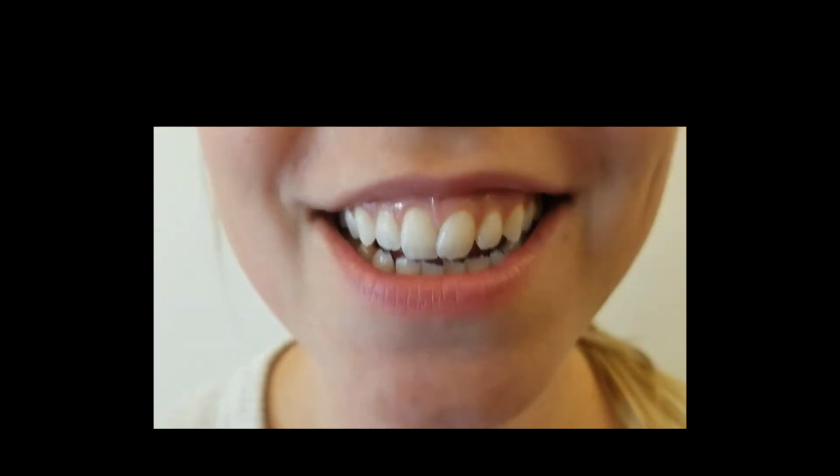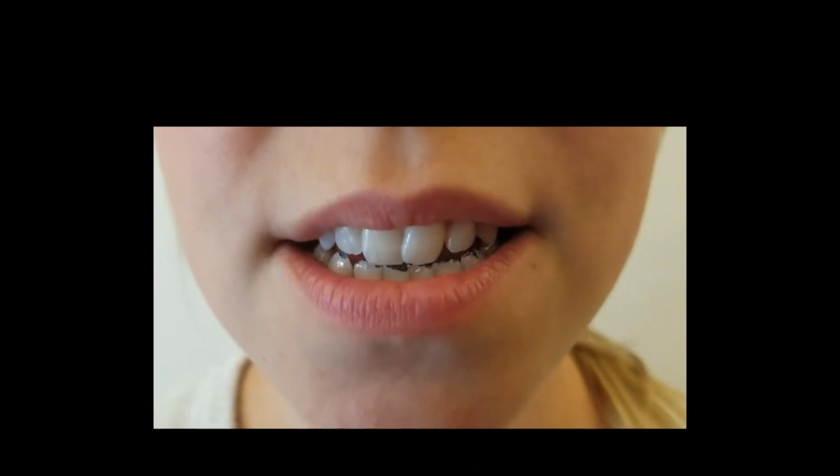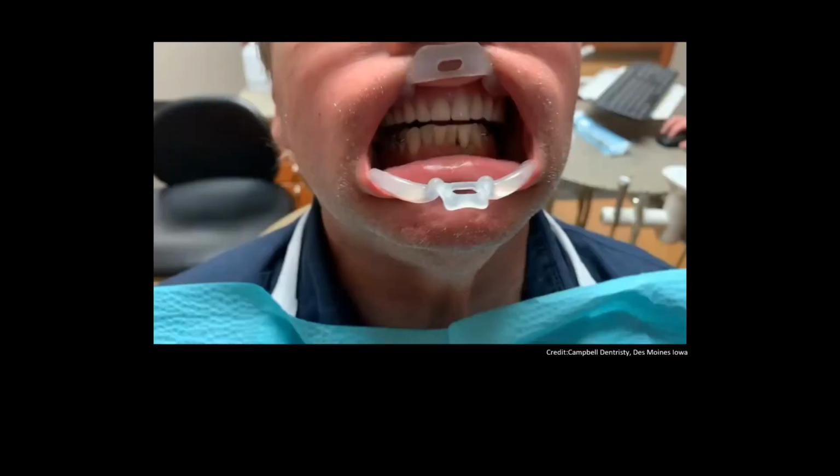This one, again, I colored the teeth on the bottom just so you can see. You can see her jaw posture. It comes out to the left a little bit, or actually her right even a little bit. So these are things that you can start to look for. So this is a complete upper denture to a cast frame lower free end partial denture.